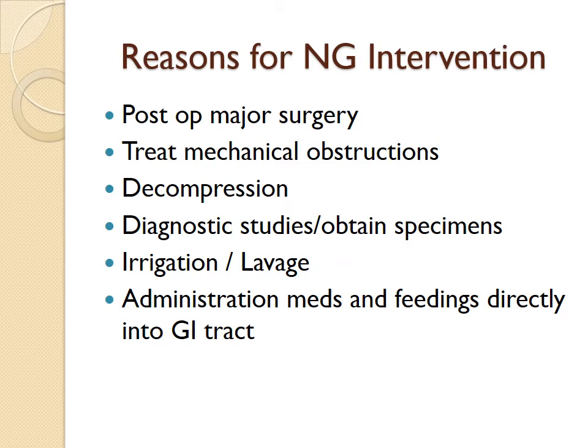But for an irrigation, and we're looking at someone who is overdosed, we'll place the tube in because we will instill sometimes chemicals that will help to combine with whatever was absorbed or ingested, and then after that you will have the need to remove it without it doing damage to the esophagus.